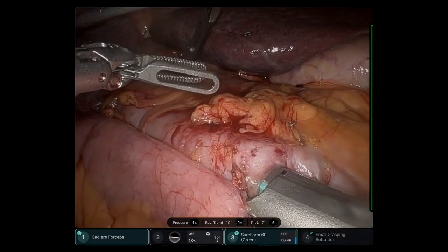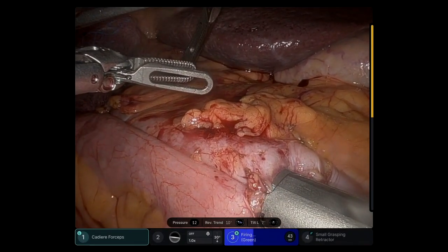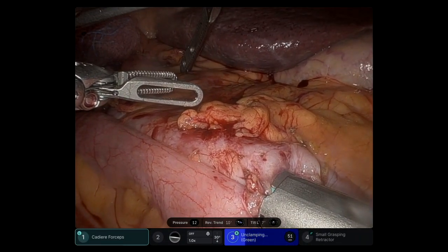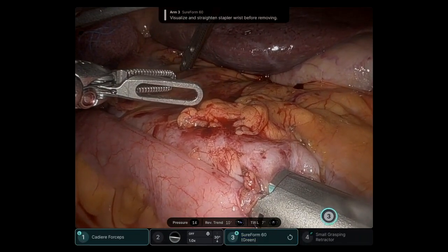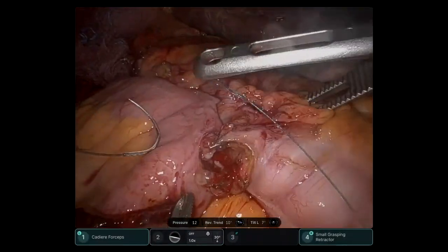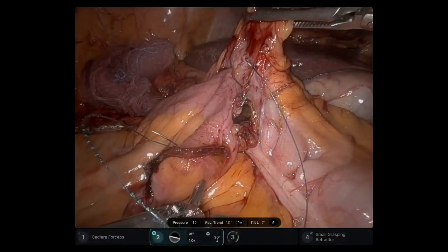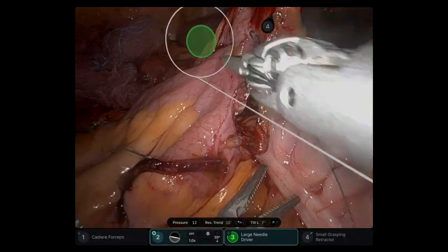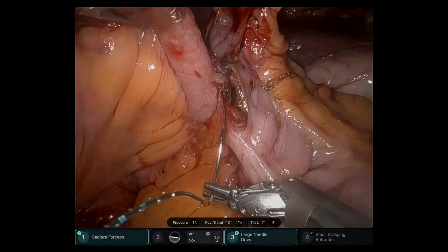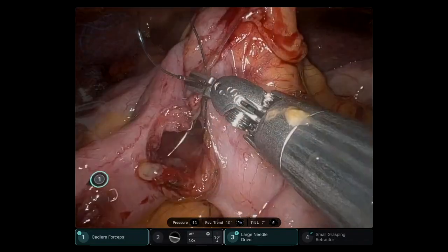Here the side-to-side anastomosis is created with a 60 mm green load robotic stapler. The common enterotomy is closed with a 3-0 V-lock suture. This is performed from the most inferior crotch, going superiorly.